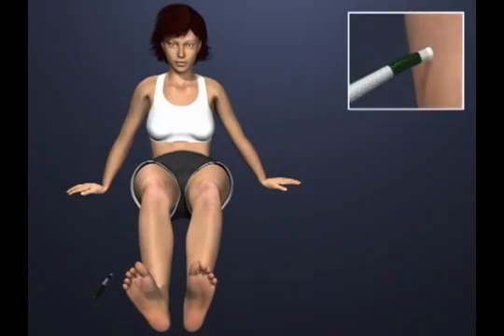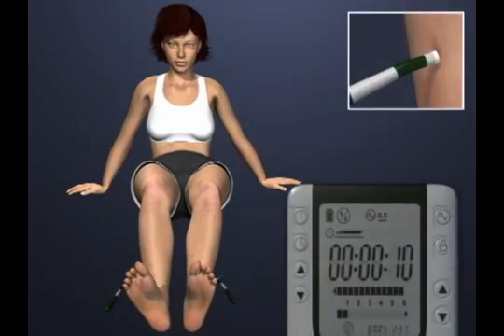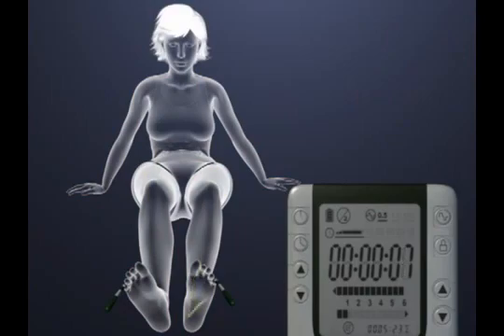The same strategy applied to the toes may be used to treat any problem in the legs, such as pain in the toes, feet, ankles, and knees, but not hips. Hip pain requires local probe treatment. Repeat as necessary, varying probe positions until your pain is completely gone or maximum relief is achieved.